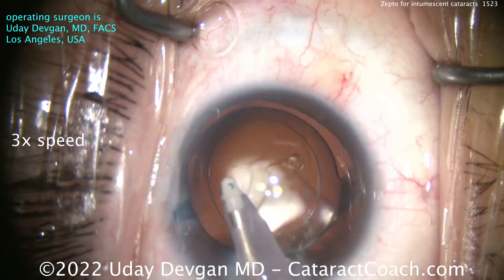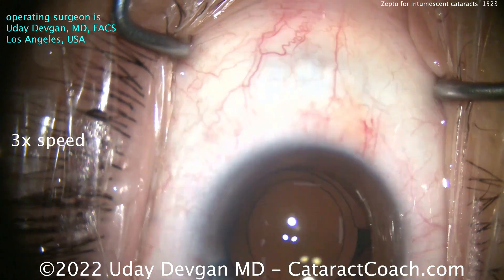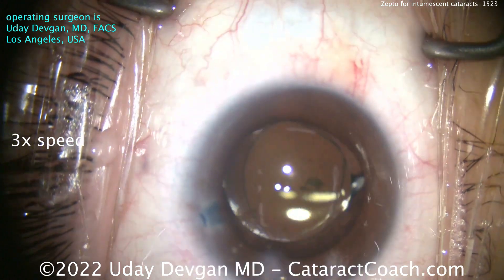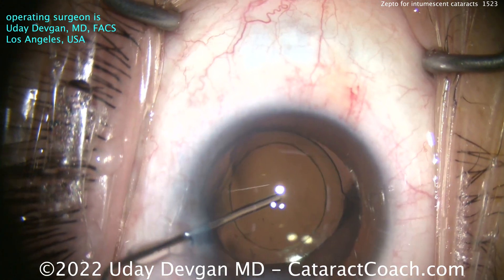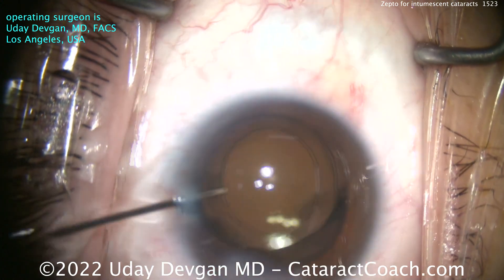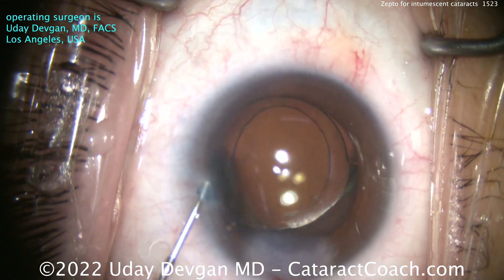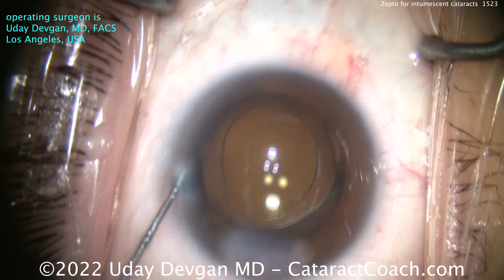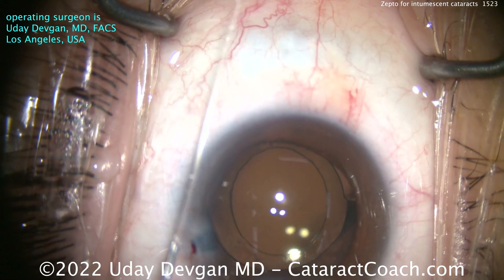And look at that overlap — wow, exactly what you want. That's a textbook result, the golden outcome. A 5.2-millimeter capsulotomy in this eye with a 6-millimeter optic, beautifully centered. Zero issues, zero potential for Argentinian flag sign or capsule runout. It just makes the case a lot more safe for the patient and less stressful for the surgeon, and that is always a great combination.